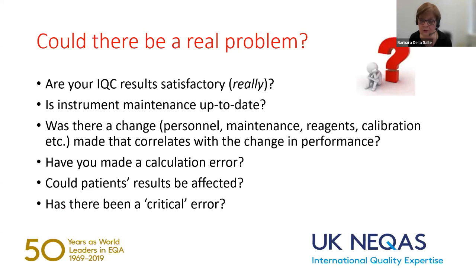And ultimately, I will also say, and this is almost the last slide, once you've gone through all these things, you always need to be aware and always ask, could there be a real problem? We do, from time to time, pick up things that have only been picked up through the EQA. And you always need to bear in mind that we do try our absolute best to make sure that the results that are sent out to you are reflective.